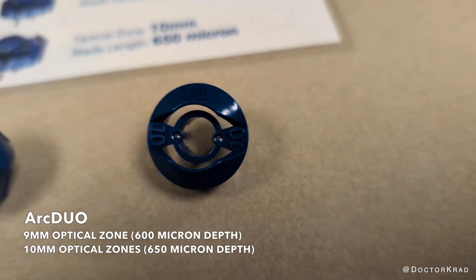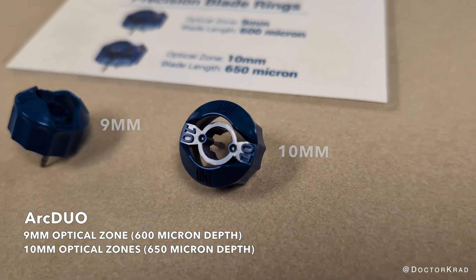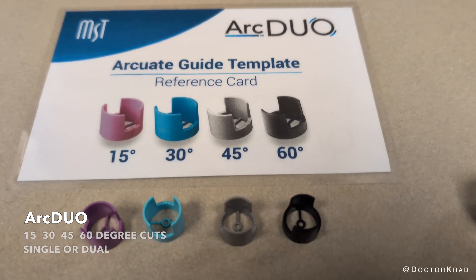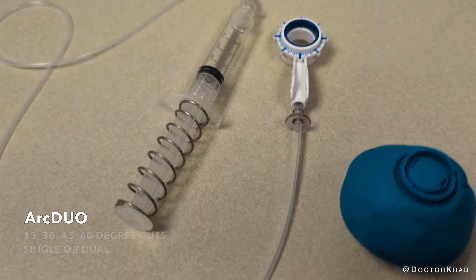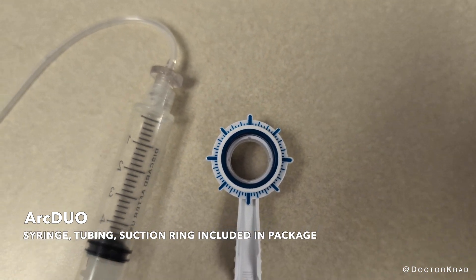Here's the ARC Duo. You can create arcuate incisions at either a 9mm or 10mm optical zone. It includes a template to make 15, 30, 45, or 60 degree arcuate incisions. These can be either single or dual. There's a syringe and suction ring to keep the eye still as this is performed.